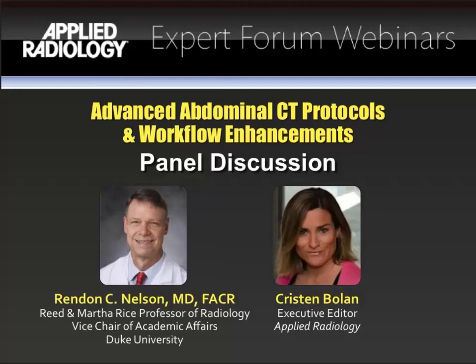And if you look at that data that I suggested with 12,000 patients, we really have seen a substantial drop in dose, particularly in the last 2 or 3 years. The worst thing you can do is do a data set that's too noisy. Because if you have a non-diagnostic scan, you basically gave radiation that was of no value at all, and that's even worse. So I would recommend, again, very minor and evolutionary changes in your noise indices to get more comfortable with the noise index. But above and beyond that, I don't think the ACR has specified noise indices, nor have they given certain noise levels that we should tolerate.